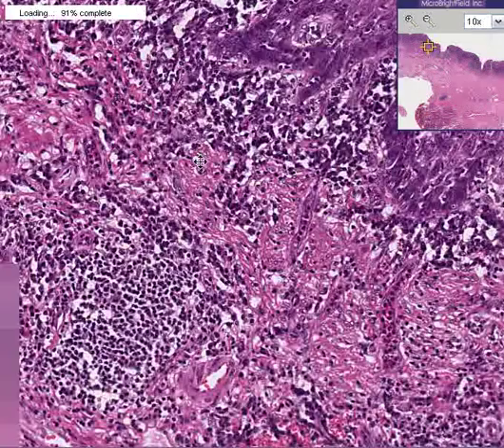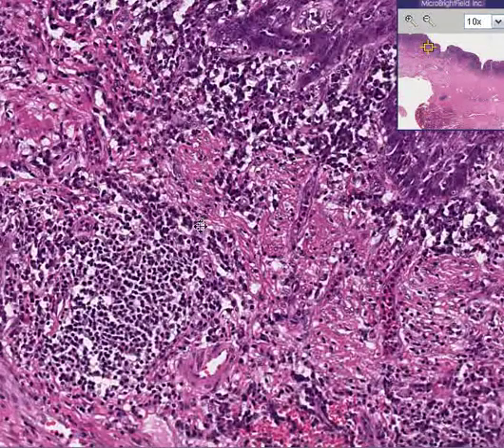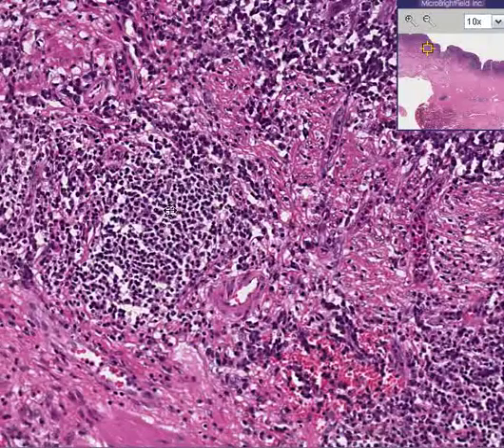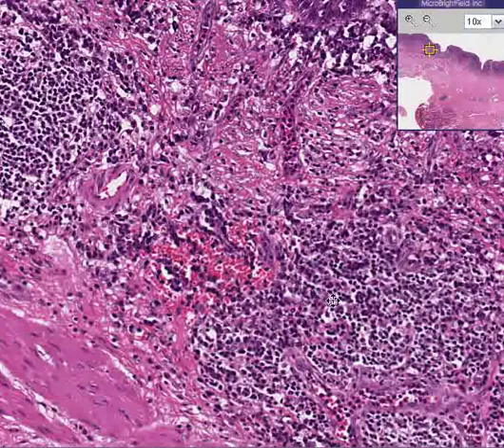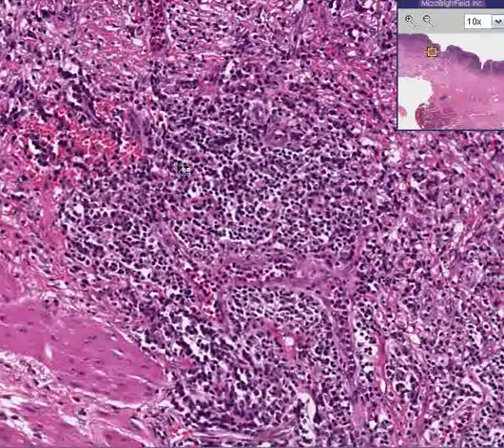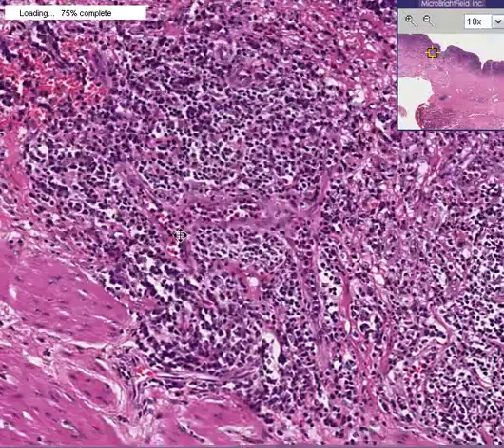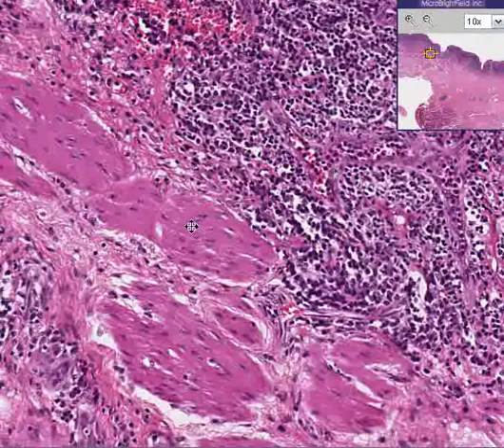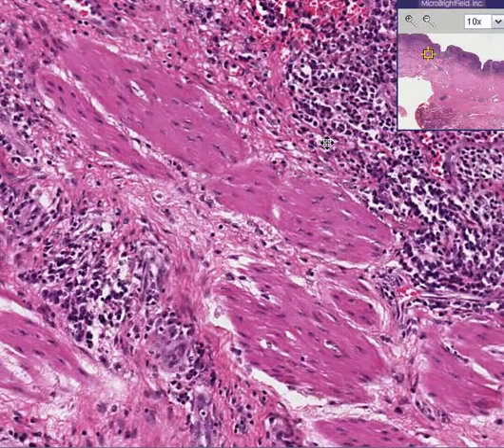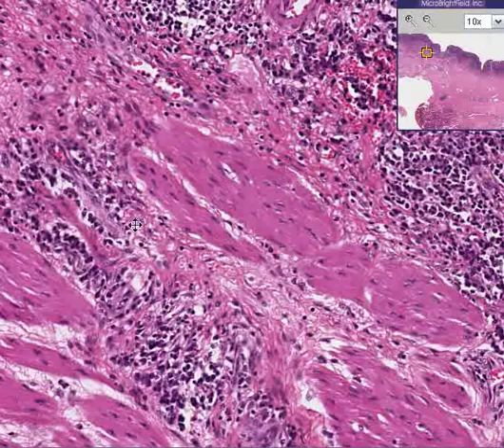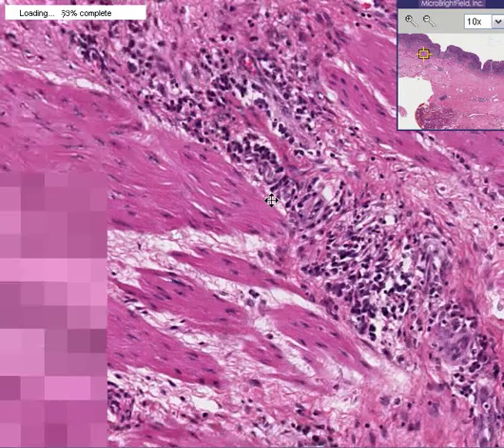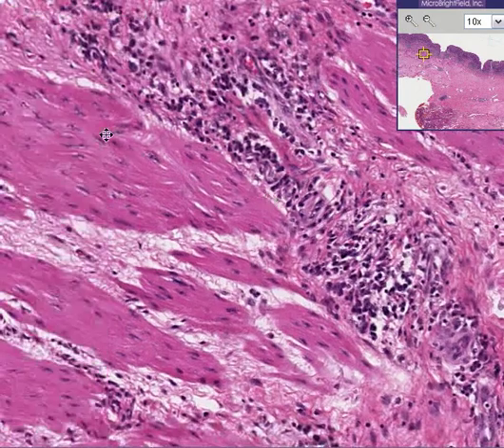These lymphocytes are found not only in the lamina propria portion of the mucosa, but also occasionally interspersed throughout the epithelial layers as well. In addition, the submucosa is loaded with lymphoid cells, both loosely arranged as well as forming nice follicles. You can also see that some of this inflammatory infiltrate does infiltrate through the smooth muscular layers as well.